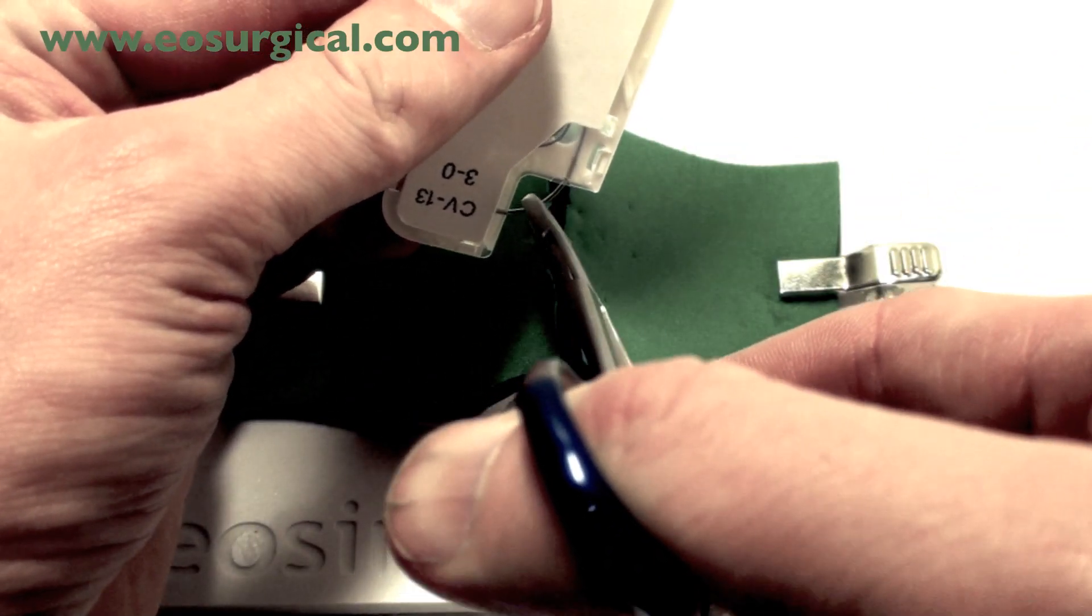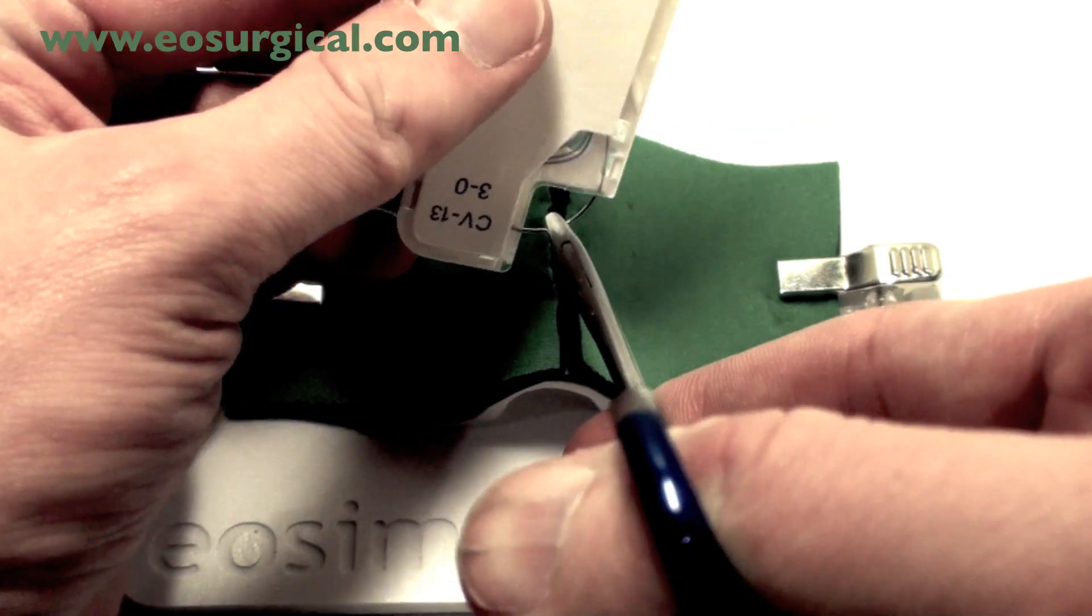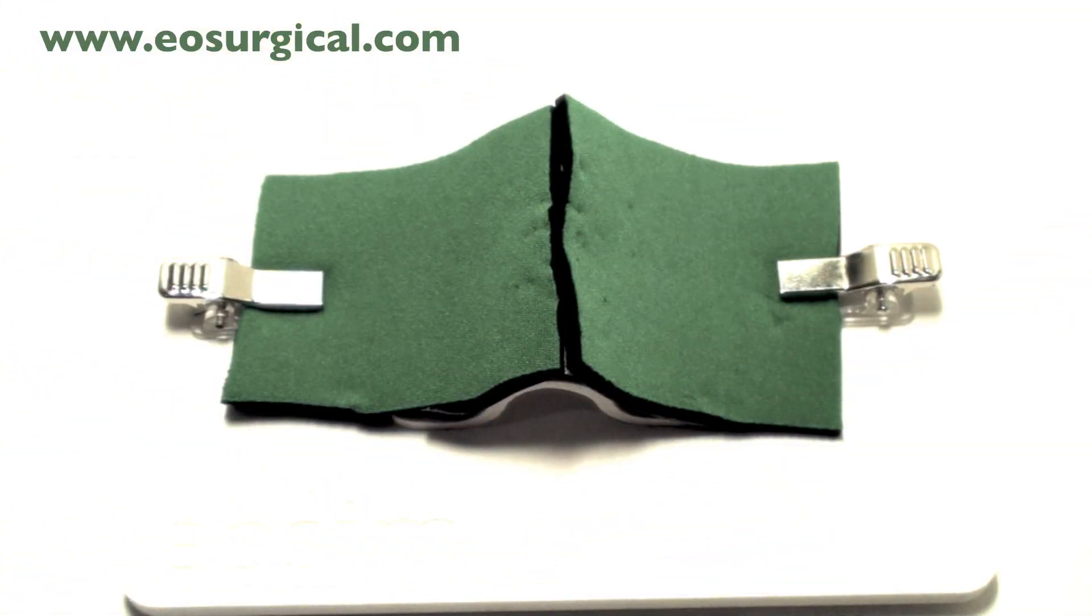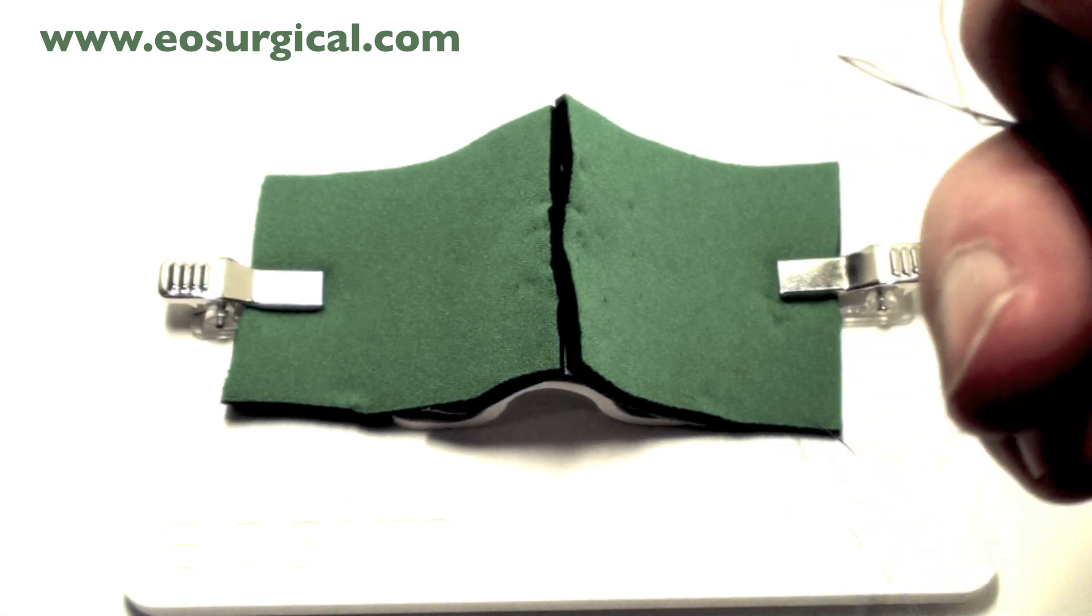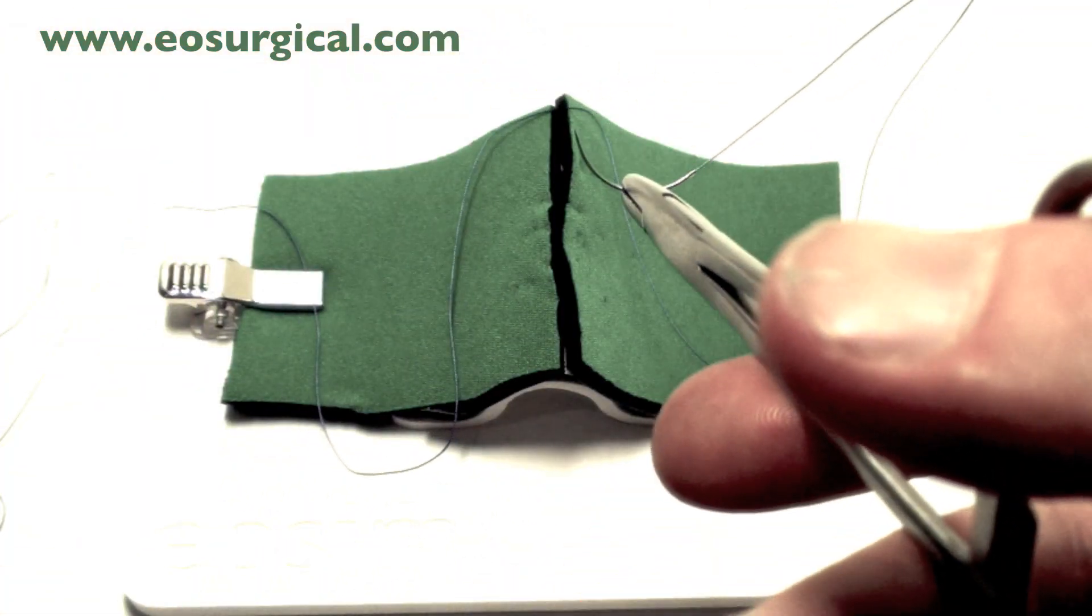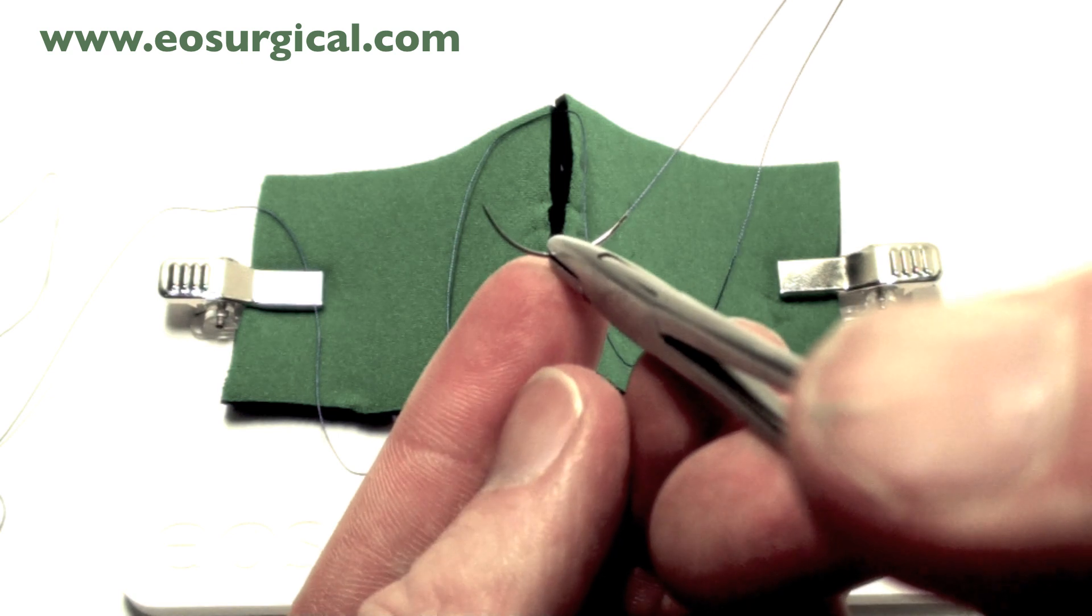First of all, you need to mount your needle. When you're grasping the needle, you need to grasp about two-thirds of the way around. Ensure that you use the tip of your needle holder as well; this gives you much better control as shown here.